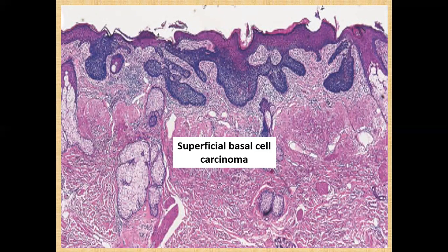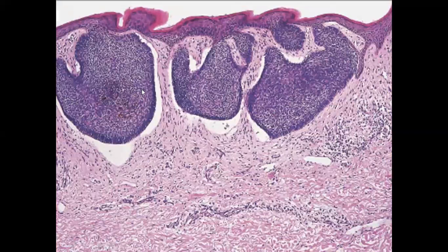In superficial spreading basal cell carcinoma, only abnormal nests of basaloid cells will be seen attached to the basal layers, and these cells can be differentiated from the normal looking keratinocytes, and the tumor is limited only superficially. However, even if the tumor is present superficially, it retains the usual features of a basal cell carcinoma, that is the presence of peripheral palisading and the retraction artifact.